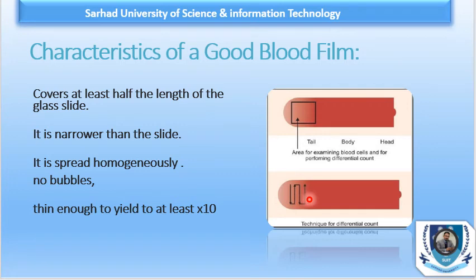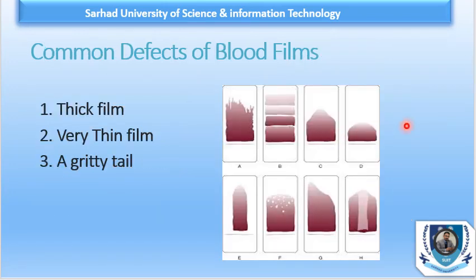Similarly, the film should terminate into a smooth, straight, or slightly curved end. It should be thin enough to yield at least 10 low-power fields where RBCs do not overlap. Whenever we are seeing overlapping, it means we are not focusing on the best area for slide morphology.